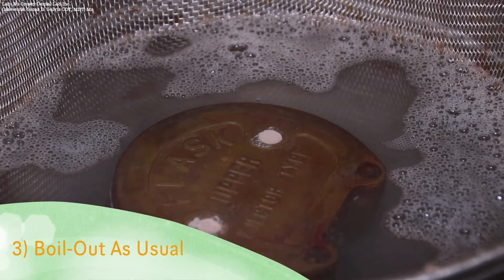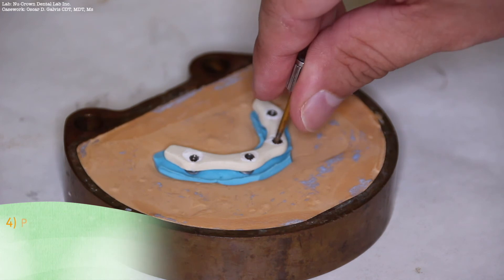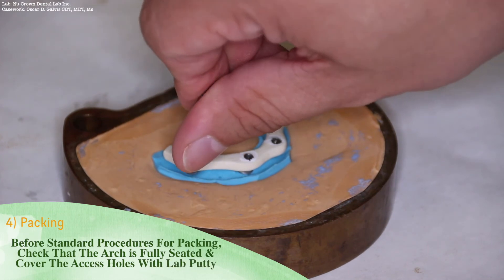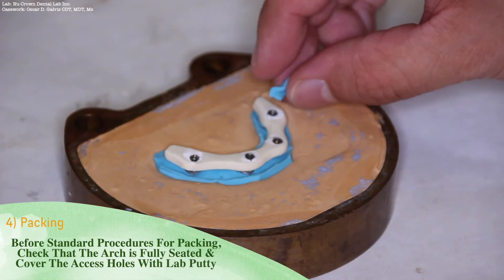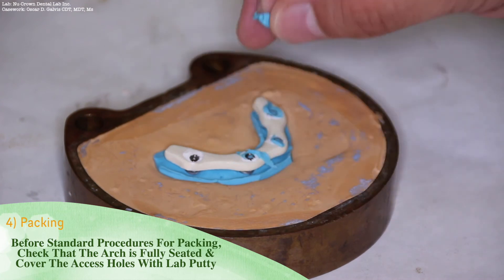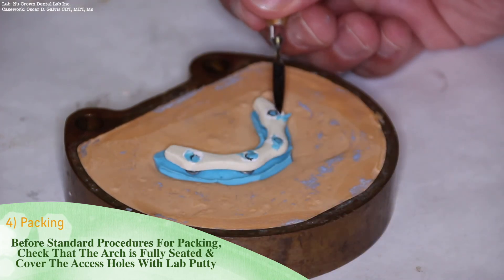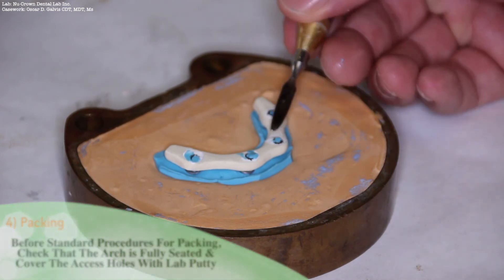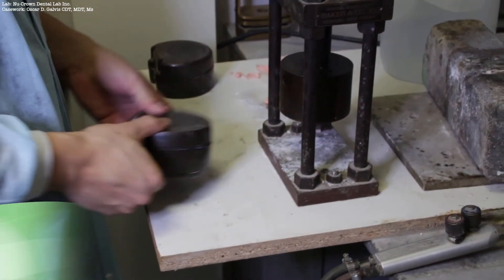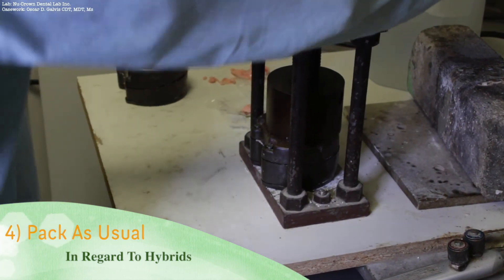Boiling out is also done as usual. Once the case has been boiled out, before the standard procedures for packing, make sure that the arch is fully seated onto the analogs, then cover the access holes and the heads of the screws with lab putty. This may also be done with Teflon tape. Since Trilor is a high-performance polymer, no bonding agent is necessary. You may pack as usual in regards to other hybrid cases.